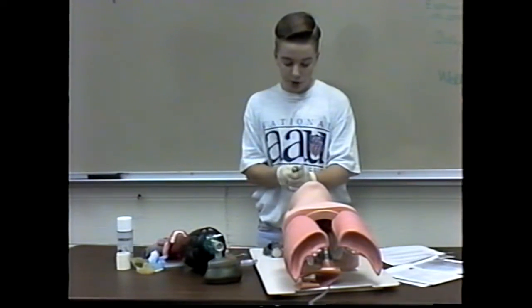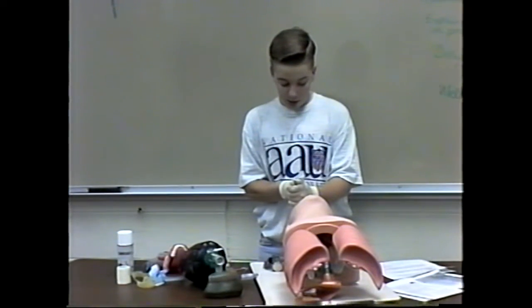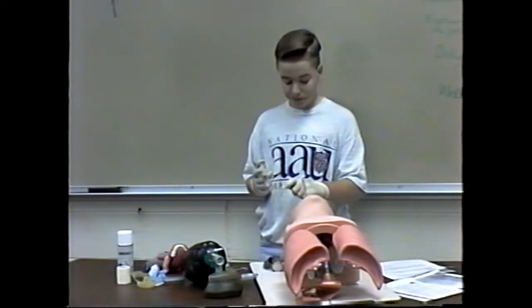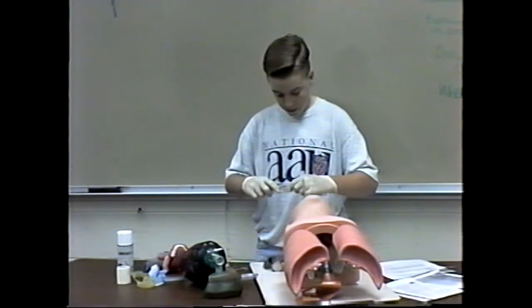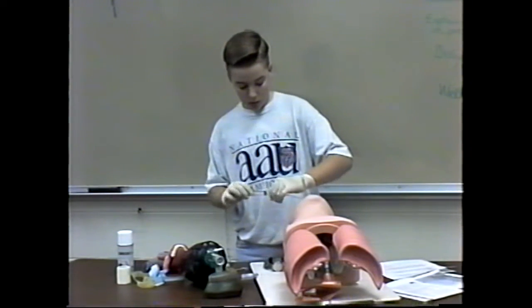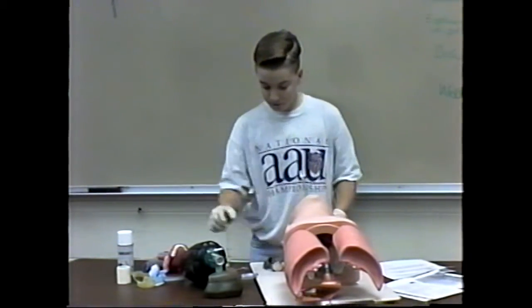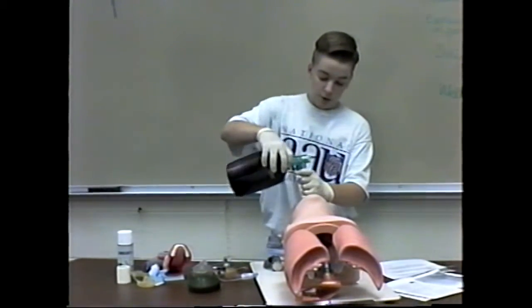It just tells you that this is blown up. Use the little syringe, and it's supposed to be in between 6 and 8 cc's or milliliters. You inflate this to 6 to 8 cc's, and then you ventilate.